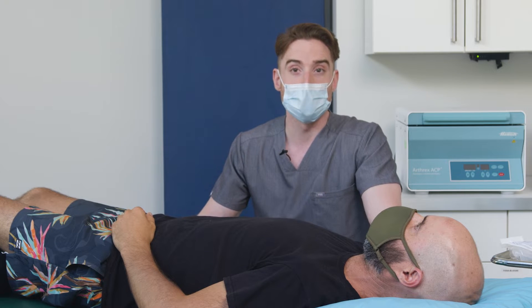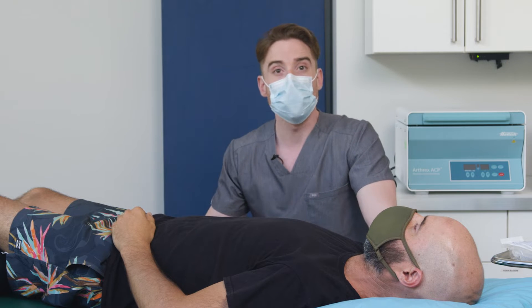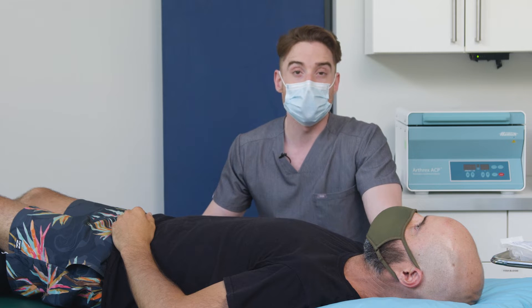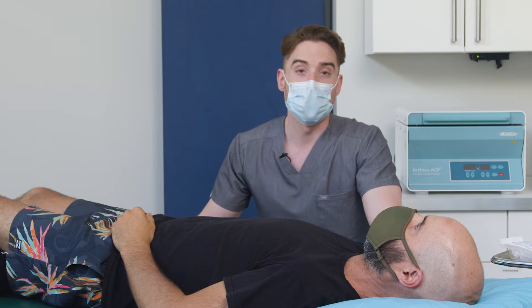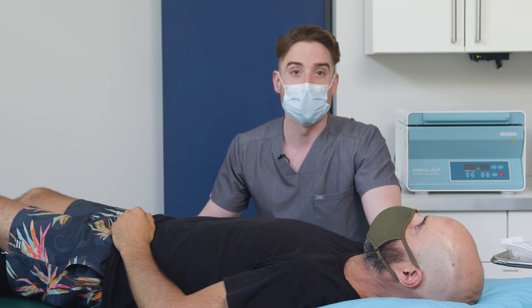Jaden is getting some platelet-rich plasma in his glenohumeral joint today under ultrasound guidance using the Clarius L7 wireless scanner. Jaden has had a history of shoulder instability and multiple dislocations over the last 10 years. We're going to be giving him some PRP to help strengthen and support the glenohumeral joint, so hopefully he gets some relief from the instability.